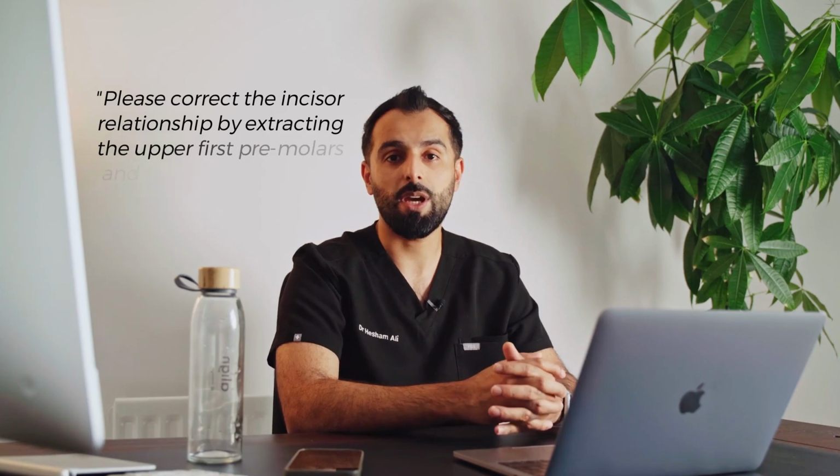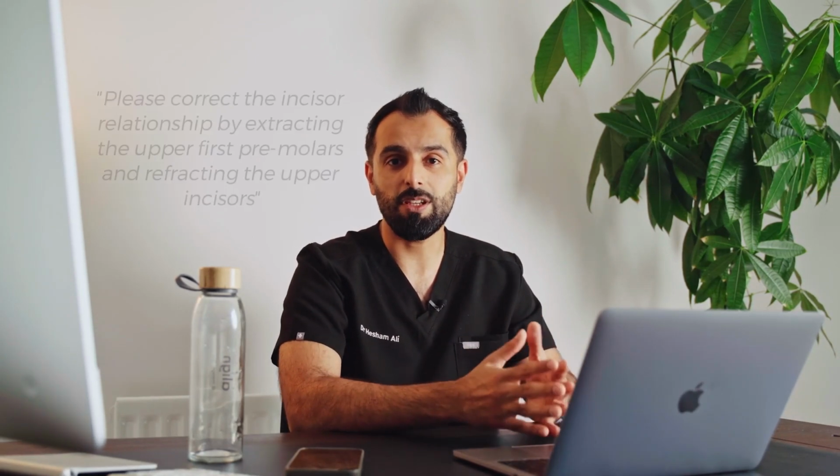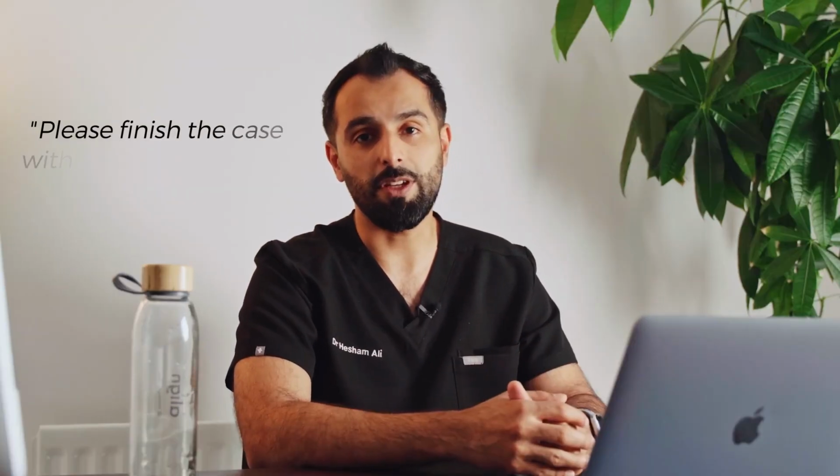And if we're not going to accept it and we want to correct it, then we have to provide the technician with specific instructions on how to do that. For example, if we're extracting upper premolars, we will say something along the lines of, please correct the incisor relationship by extracting the upper first premolars and retracting the upper incisors. Without this specific instruction, we can't request an overjet correction. There's no point in just writing, please finish the case with an overjet of 3 millimeters, because unless you prescribe the mechanics to achieve that, the technician will provide you with a plan which doesn't work. So be very specific in the type of movements you're prescribing and what you're trying to achieve.